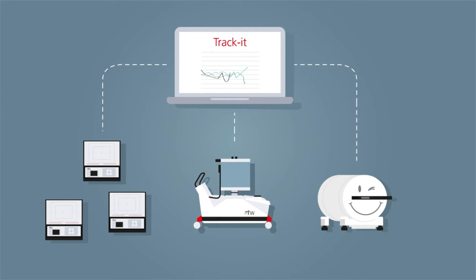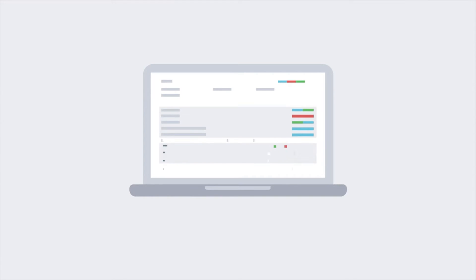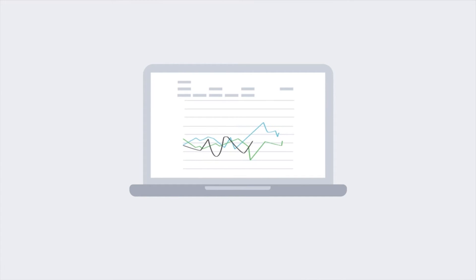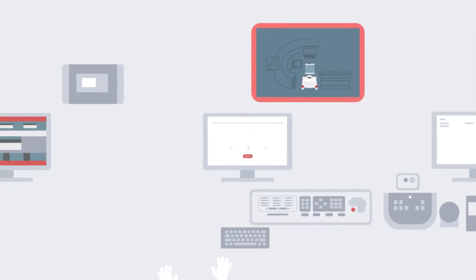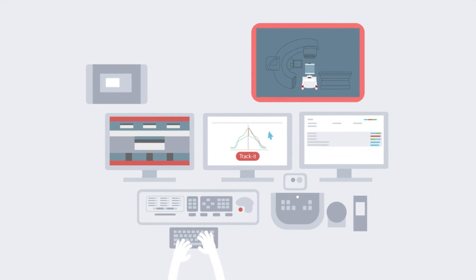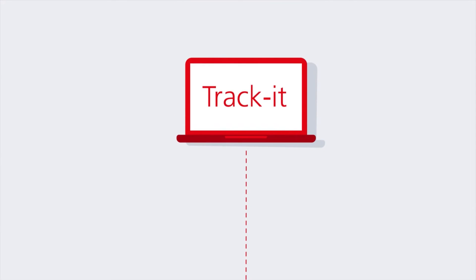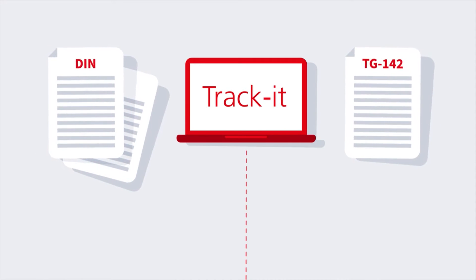The report function allows you to produce compliant documentation and see all QA tasks and results, as well as trends, in clear, easy-to-read graphs. To do that, just start the measurement as normal. After completing the analysis, click on the Trackit button. The data will immediately be exported to Trackit and automatically incorporated into the appropriate reports.